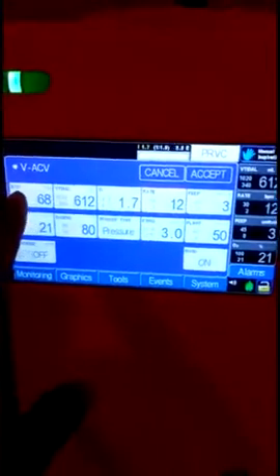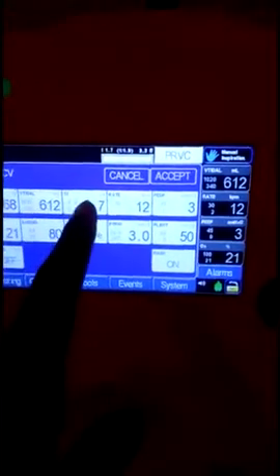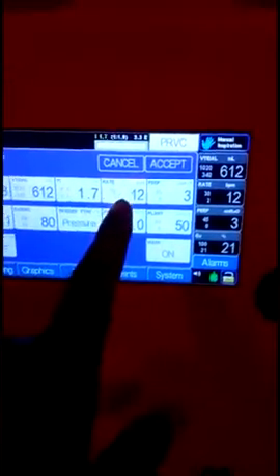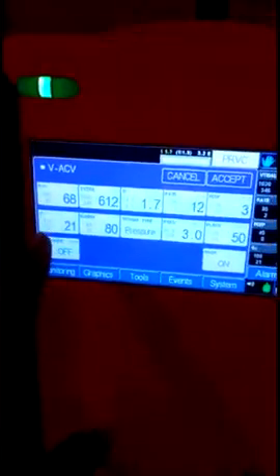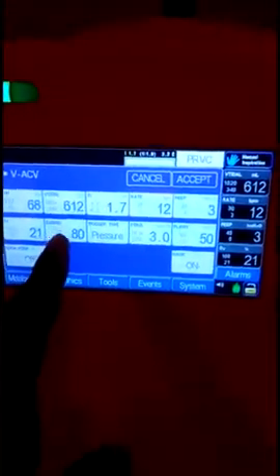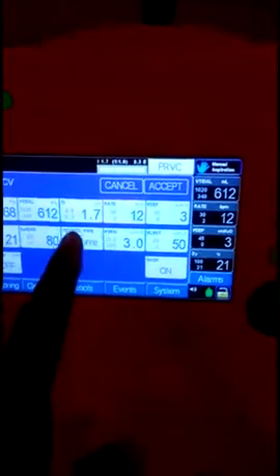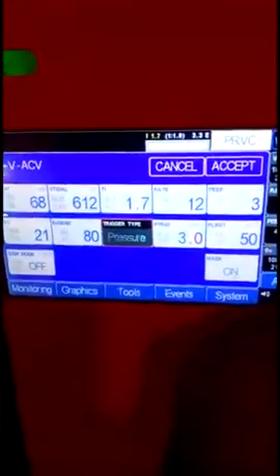When you turn on the mask option, it will work as a non-invasive ventilator. It will compensate for all the leakages happening from the side of the mask, and it will also show how much leakage is occurring — displayed in liters per minute at the top of the screen.